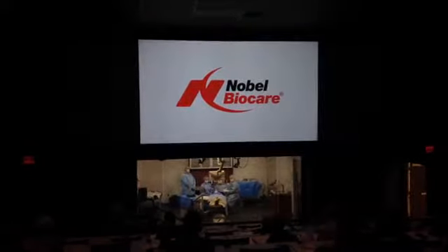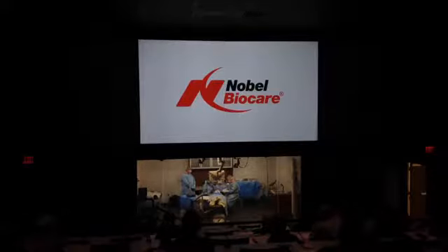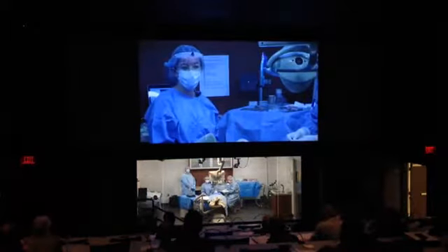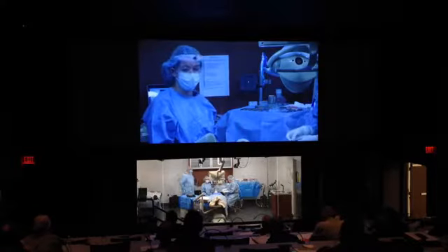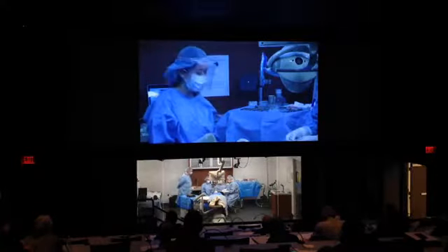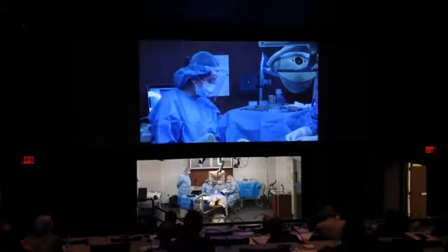I'm going to come and say a proper hello a little bit later on, and I'm here with Greg from Calceram, from DaVinci now. And then we have Helder, my assistant for 10 years, and our beautiful patient here, Anna Maria, and she's ready to go. She took a little bit of a sedative, some Halcion, which is a great sedative for these procedures for the patients. It doesn't have to be with IV sedation. And I want to talk to you a little bit first about what we're going to be doing.